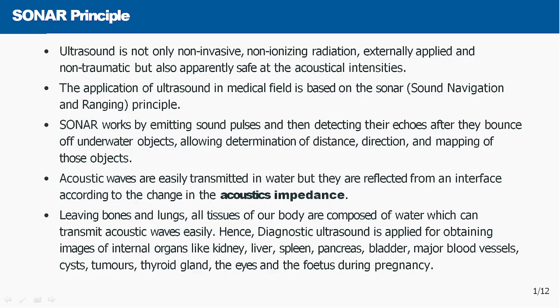So how do these sonars work? Actually, these are sound pulses generated by a transmitter or a source, and then they travel through the medium. If there are obstacles in between in their path, then from that obstacle the sound waves will be reflected back.